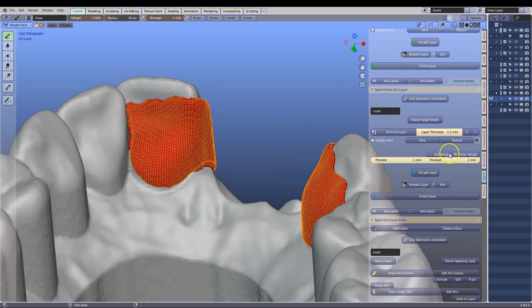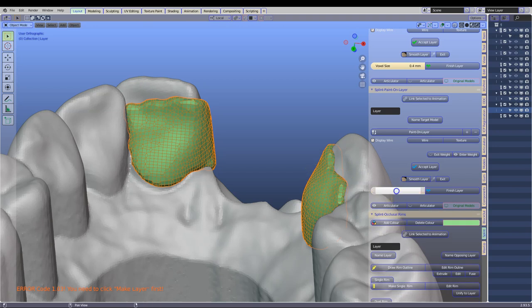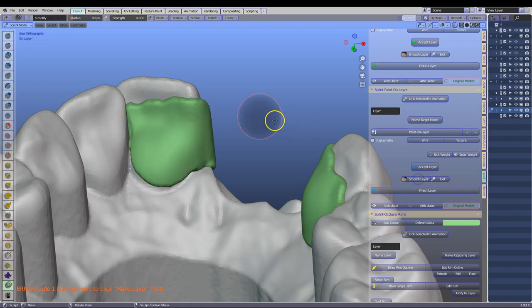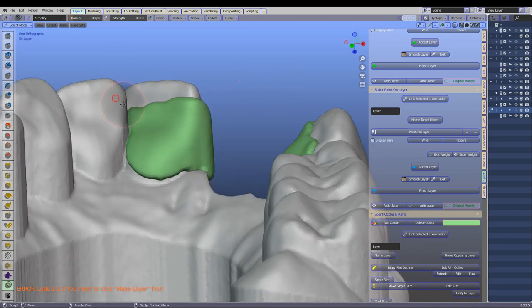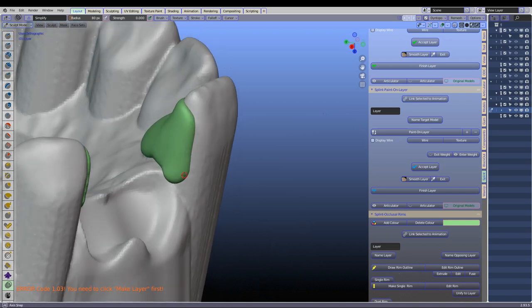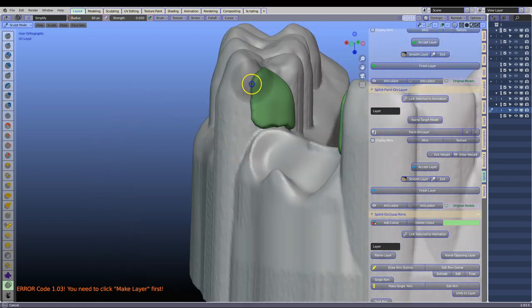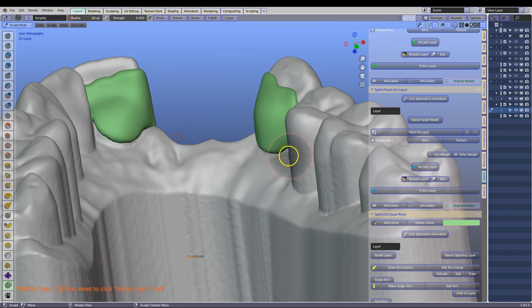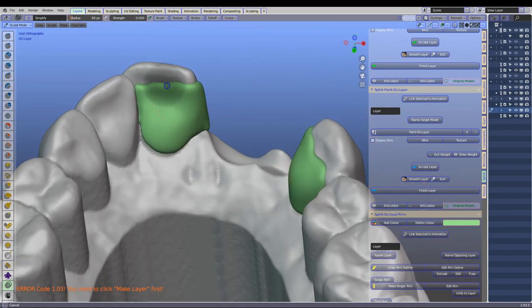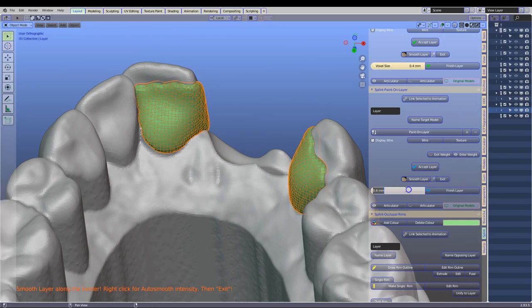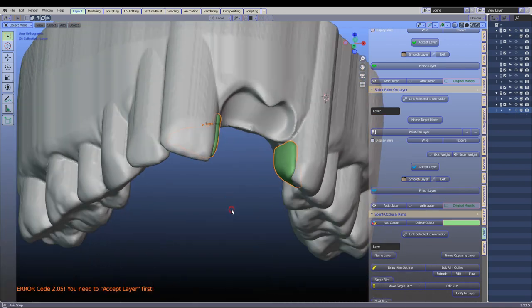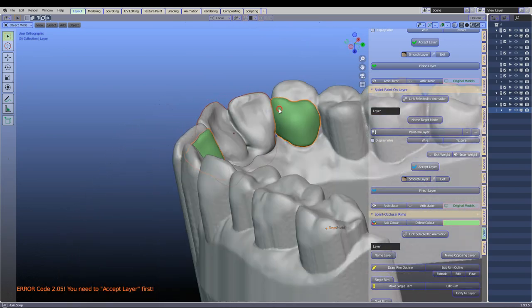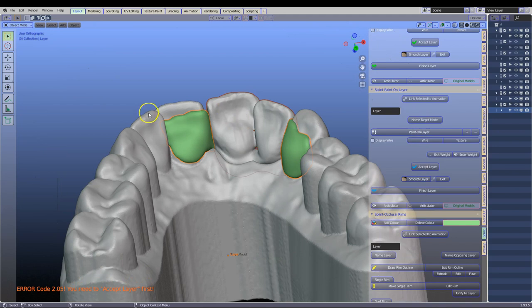Then we are going to accept these. So click on accept layer. The layer voxel size we are going to make quite fine. So it is 0.2mm. But I want to smooth these down while I am at it. So in the Dynotopo put the smoothing to about 6 so we can get a fine smoothing. As you can see it gives us a nice wing. That is one and that is the other one. Now it is vitally important that the fitting surface is cut out at the very end. Exit that. Again voxel size 0.2 to make it nice and fine. All right so Alt H to unhide. Now what we want to do is we want to connect these up. And that is quite easy to do.